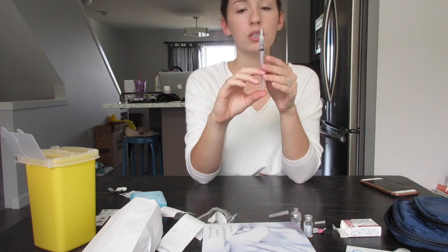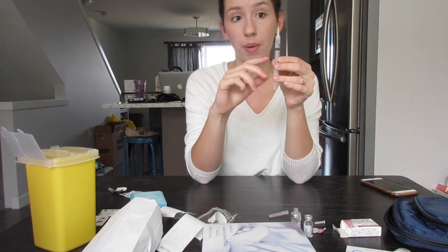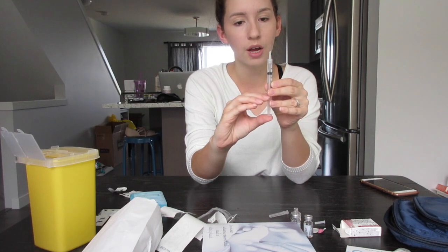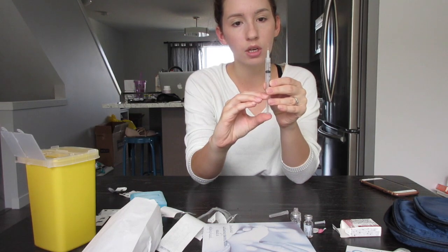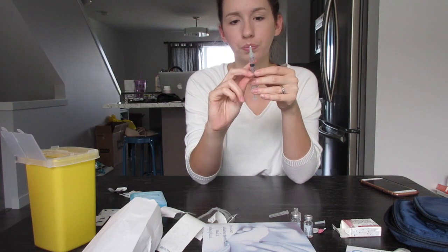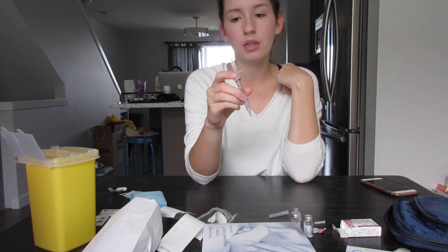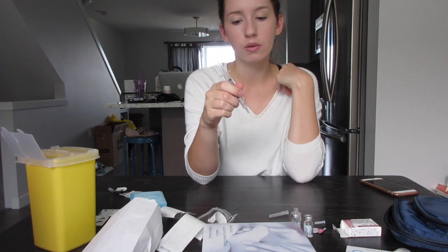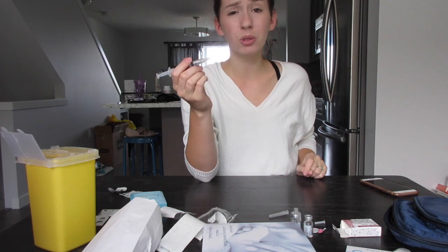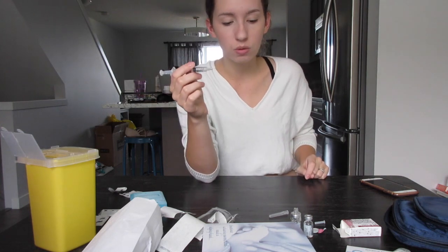But what you need to do next is push the syringe until you see the first drop come out of the needle. So just very gently, because you don't want to shoot it out or waste it, you'll push very gently. Oh, and I see the first drop. So that means it is all ready to go. So this one, the nurse told me to hold more like a pencil, and then you'll use your finger to push the plunger down as well. I just say do it however feels the most comfortable, because you don't want to be jerking your hand around while you're doing it. So do what feels comfortable.